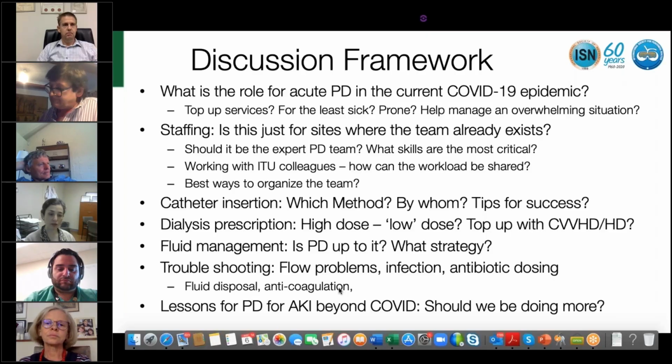So we had a huge increase in the number of patients we were tending to, and we had a lack of resources, personnel, as well as dialysis resources. A lot of these ICUs, the nurses were not trained to deliver CRRT. There were no water hookups, so dialysis was not an option. So we quickly thought on our feet and came up with the solution of acute PD.